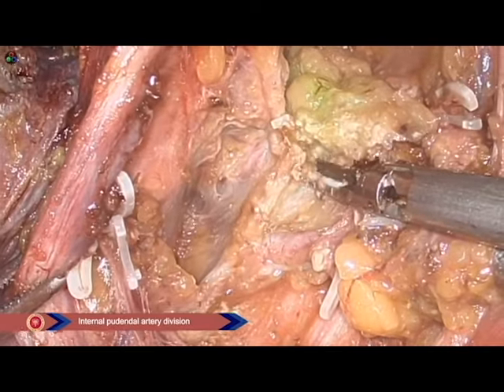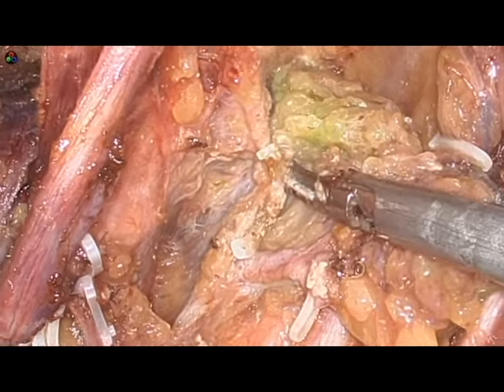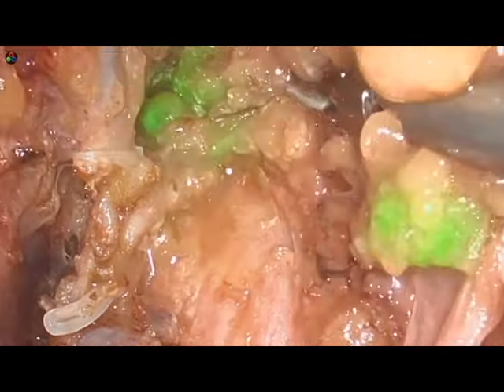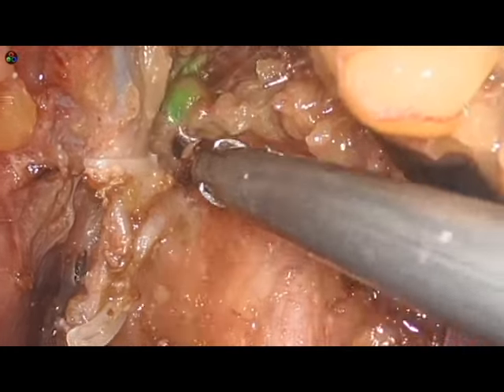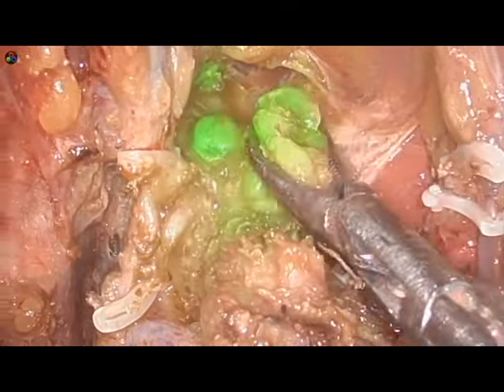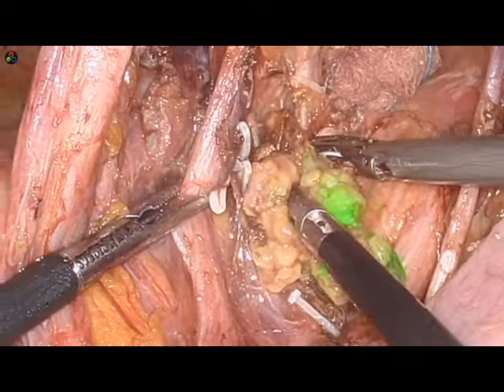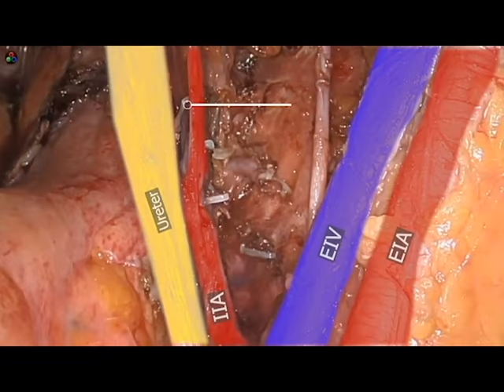The internal pudendal artery was safely clipped and divided. After lateral pelvic nodal dissection, we can identify the skeletonized ureter, the internal and the external iliac vessels, and the obturator nerve.